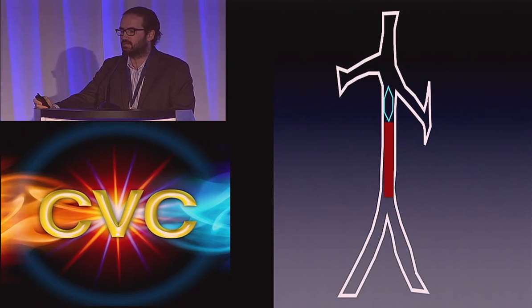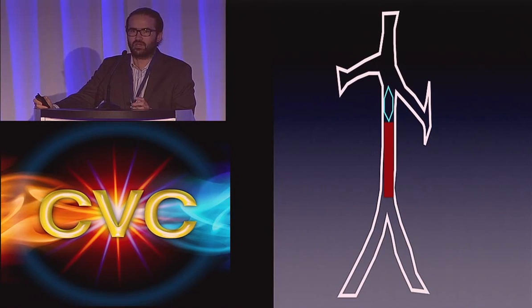So this is just a small little chart to explain what the Trellis technique is all about. There's actually just two case reports in the literature of utilizing this device for IVC. Be mindful that for CME issues, this is out of the IFU of this device. This device is actually marketed to treat iliofemoral DVTs.